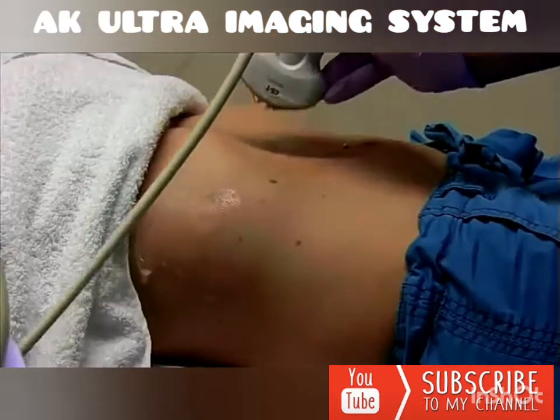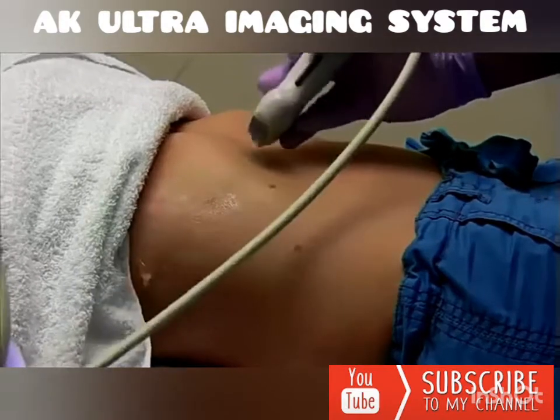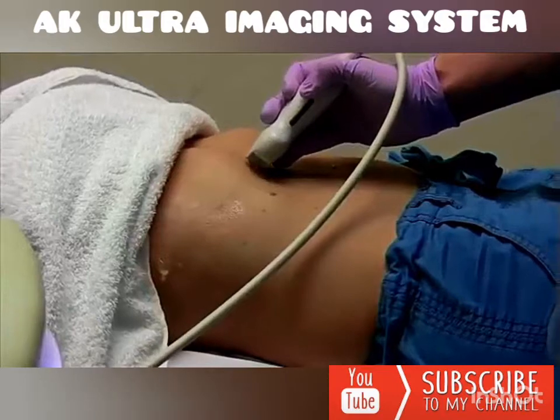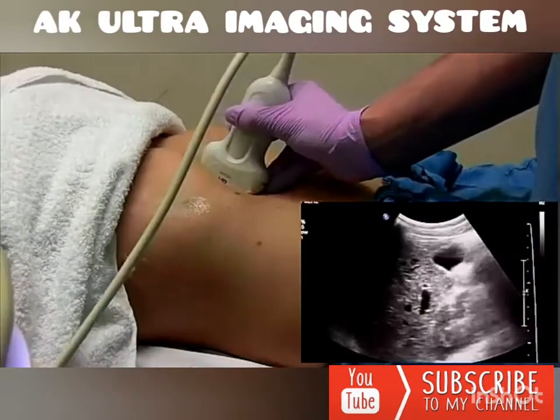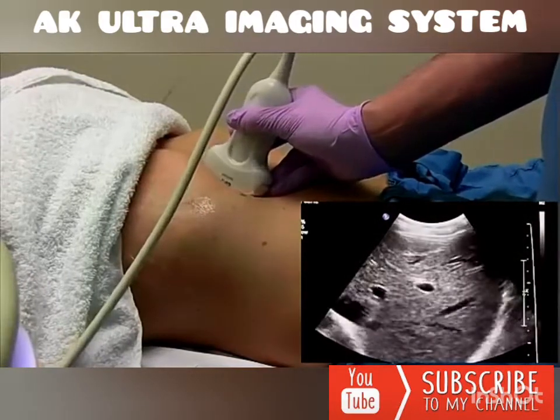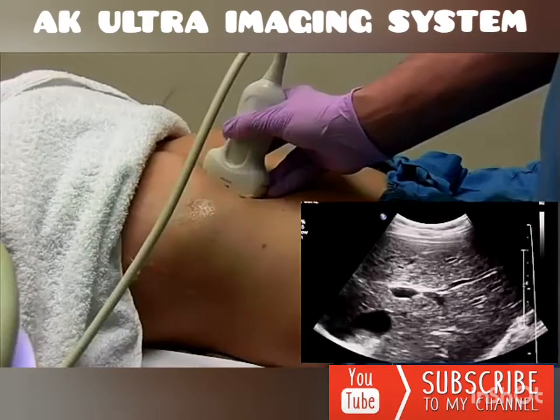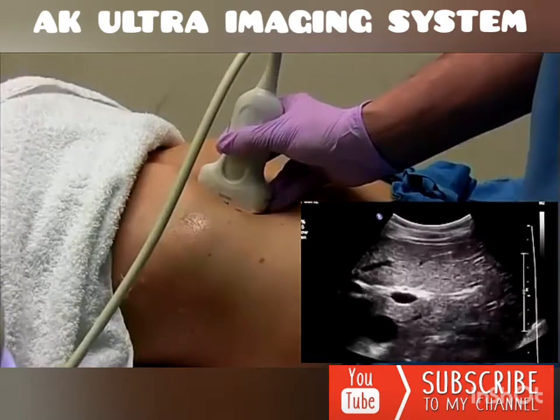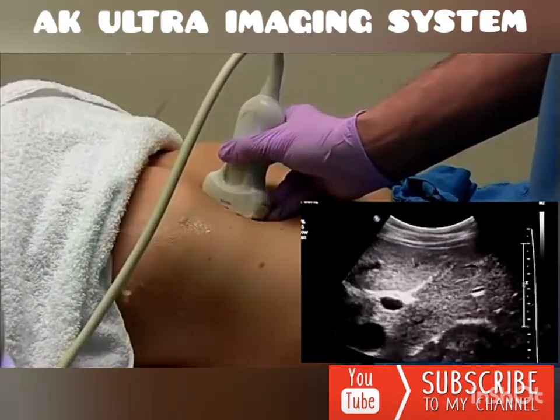Next we're going to show you how to image the gallbladder, and you can really use two windows depending on which one works best for the particular patient. One of the two windows that I usually use is a subcostal window, and your probe may be slightly obliqued to the patient's body, but essentially what you want to do is open up the gallbladder completely.